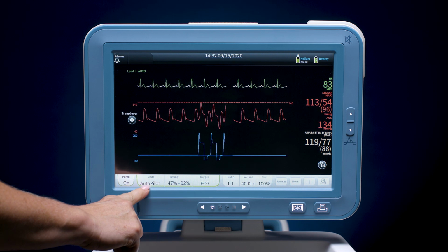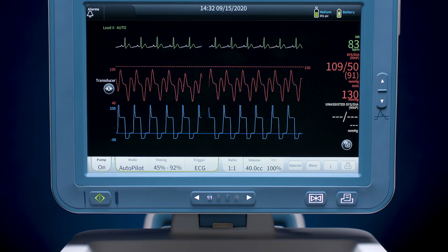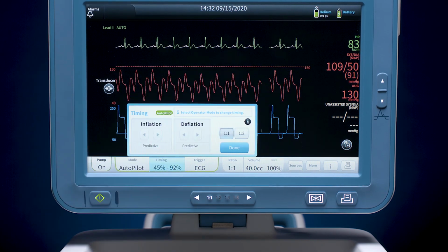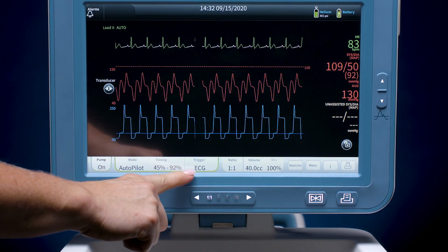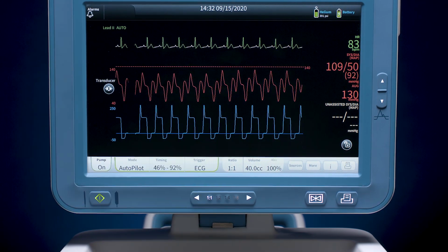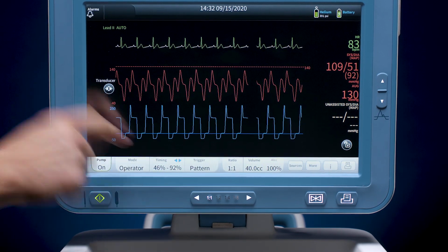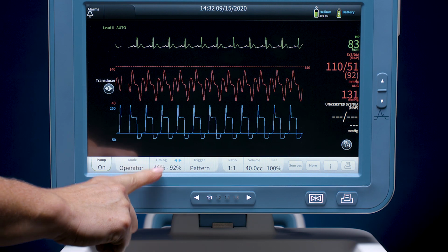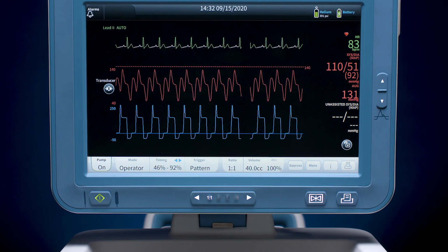The AC3 Optimus IABP has two modes of operation: autopilot mode and operator mode. The default is autopilot mode. In autopilot mode, select and change settings to maintain optimal counterpulsation with minimal user intervention. ECG source and lead changes, AP sources, trigger changes, timing method, and timing adjustments are made automatically. In operator mode, a clinician can select and set most IABP functions. This will include selecting timing adjustments and trigger adjustments.